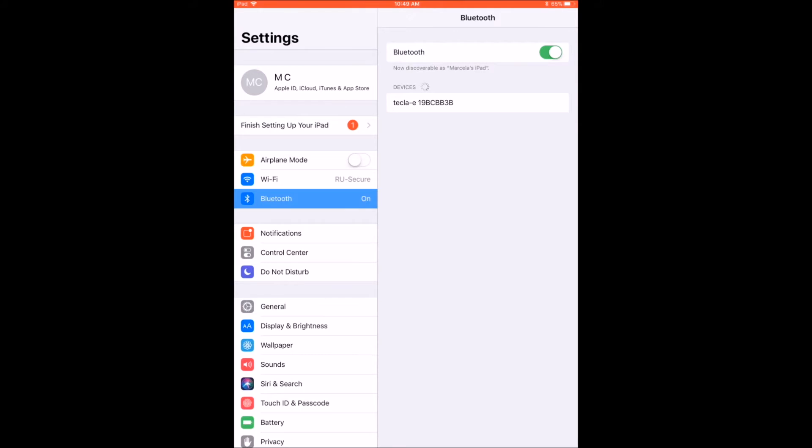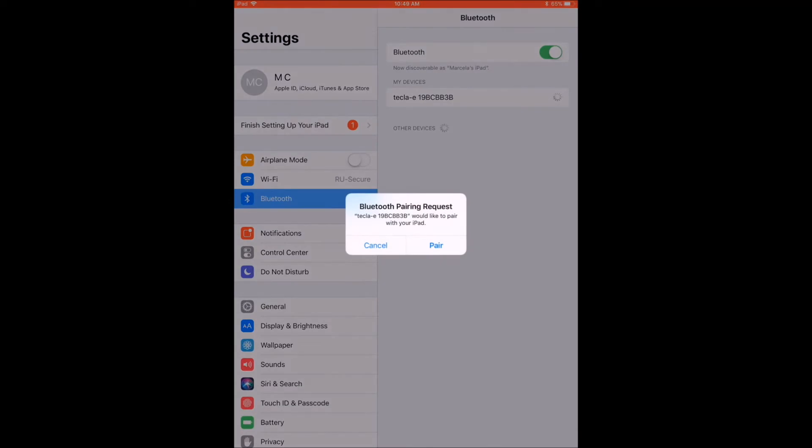Once your device finds the Tecla-E, it will show up in the Other Devices list as Tecla-E, followed by a string of characters. Go ahead and select this item, and when the pop-up window appears, press Pair.